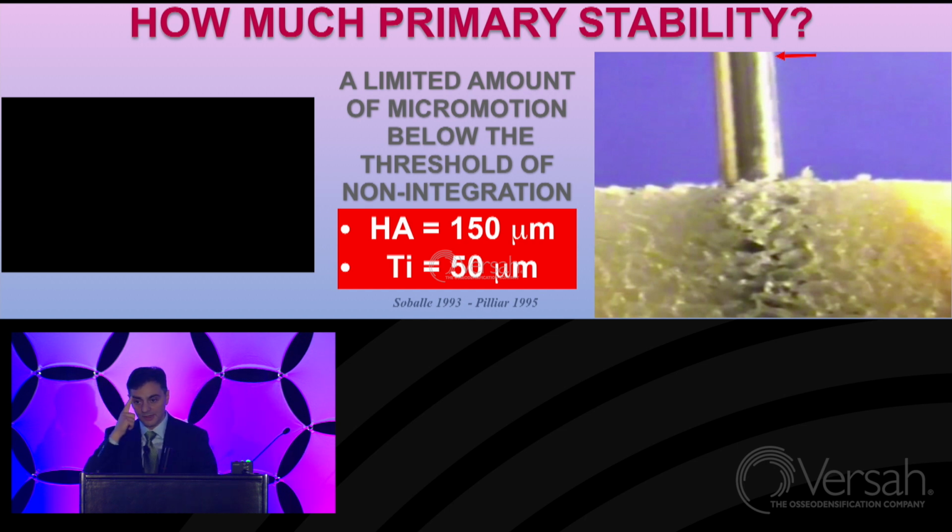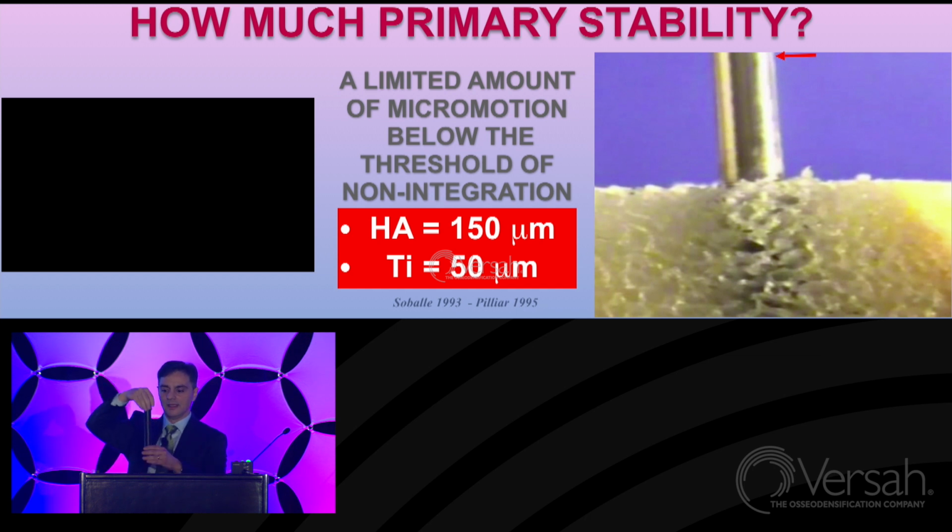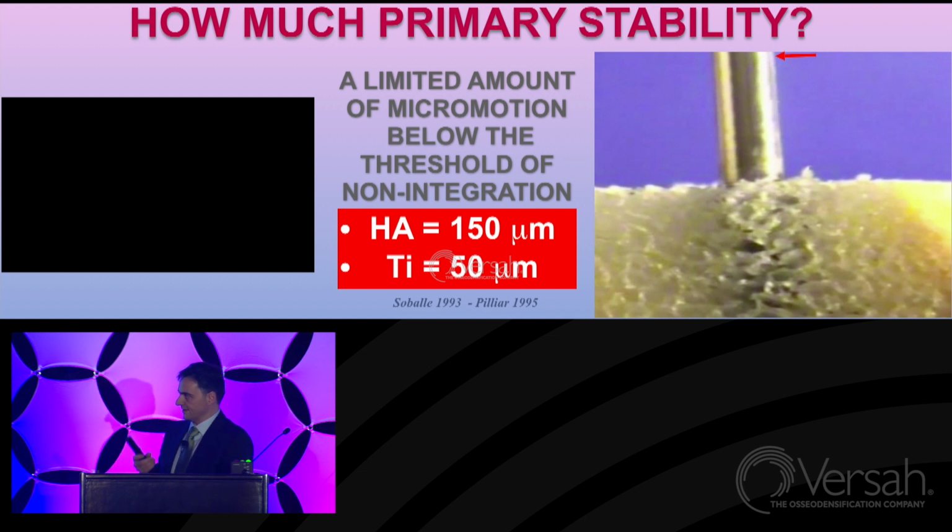Now, keep in mind that our ability to see with eyes, without magnification, is 100 microns, which is 0.1 millimeter. So it's between the limit of eye resolution. Because with our eyes, if we are good enough, we can see up to 0.1 millimeter, which is 100 microns. If you take a long abutment and you try to move it, you will see the movement immediately because of the long arch. You can see with your eyes. So you don't need such difficult instruments.